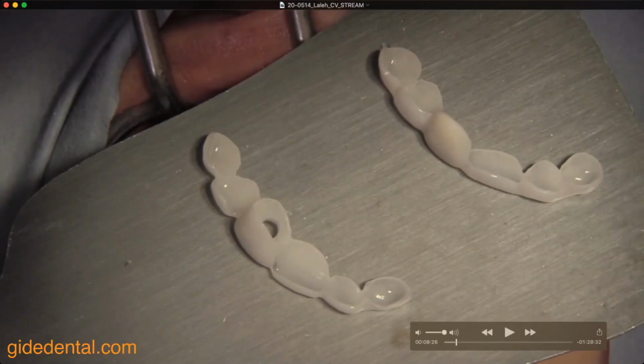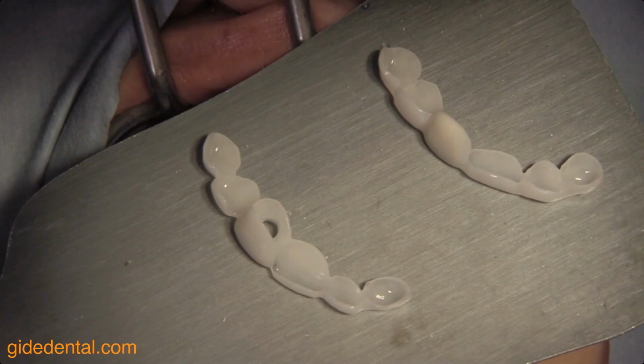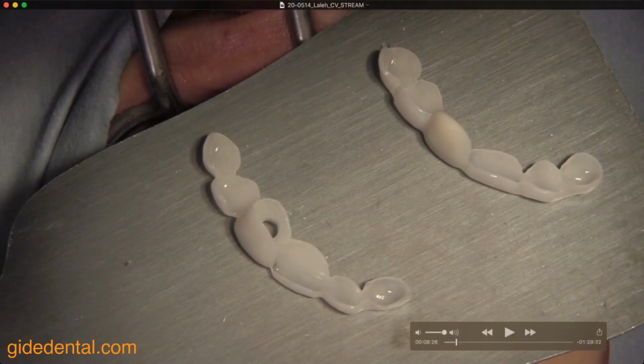Here is my preparation, which we did. When you look here, I made two different shells here. This is done in collaboration with our prosthodontist, Dr. Francesco Mitroni. And the left one will give us already a shell for the eventual temporary crown. And the right one is my surgical guide to place the implant. So we basically made two shells which have cantilevers, so they're stable on the adjacent teeth. And this is what we're going to use in the surgery and in the post-surgical treatment.